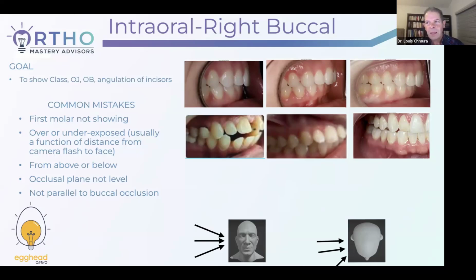The problem is knowing ahead of time which case is going to be the perfect teaching case. You don't know that. So I know it's going to be difficult, but really you can take the intraoral and extraoral photos in 5 minutes, 3 minutes. It doesn't take long, especially after you've done it a few times. You know exactly what you're looking for. You have it in a sequence.